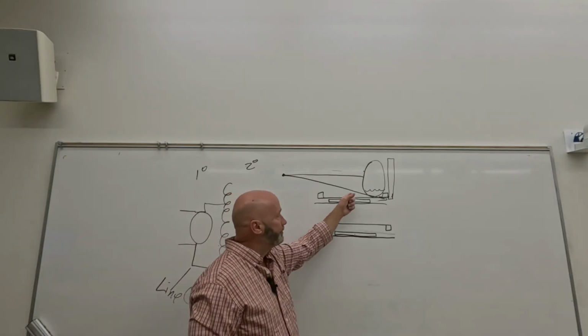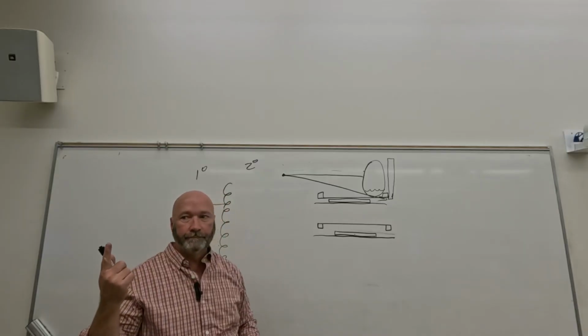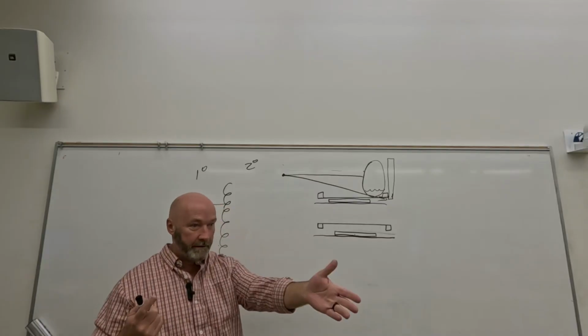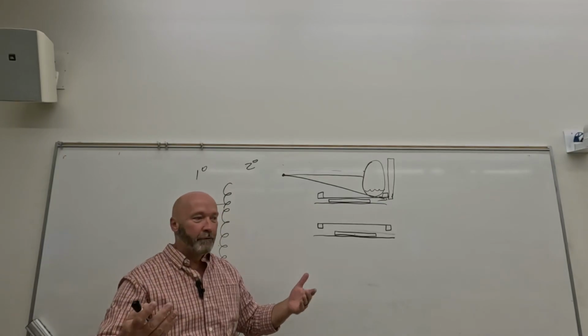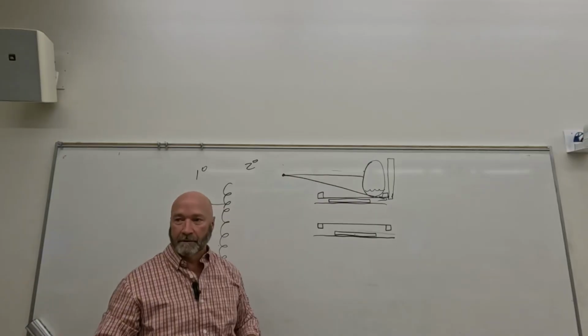They both have to have the same characteristic in that our tabletop has to be two things. Radiolucent, and what are you wearing? Your clinical, what's the word? Uniform thickness, right?